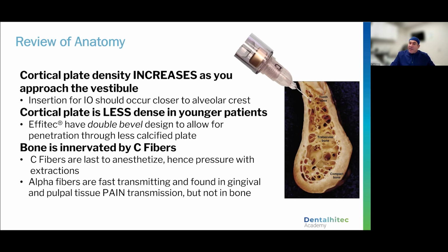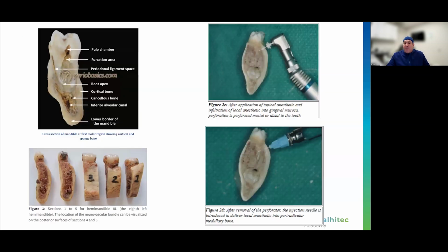So if your patient makes a noise, if you see them move a little bit, they're likely not feeling pain, they're feeling pressure. And sometimes I have to remind parents of that because they may say, oh, is it hurting them? No, it's a little bit of pressure. They're just feeling the pressure of that local anesthetic.